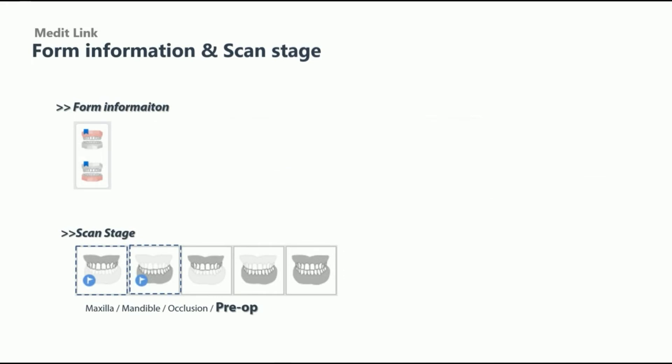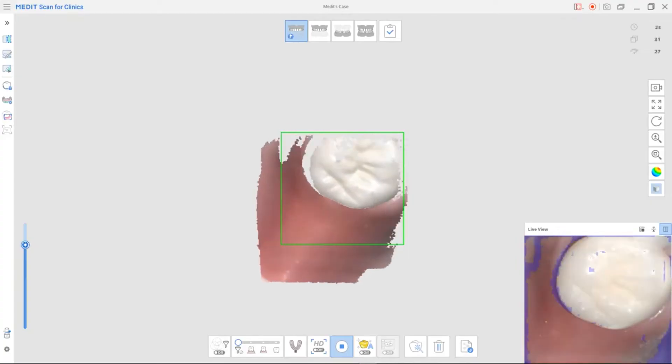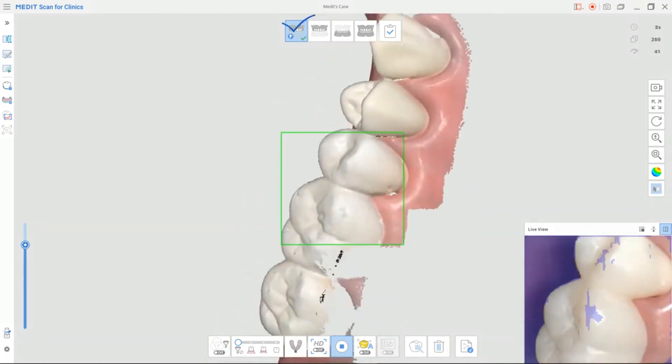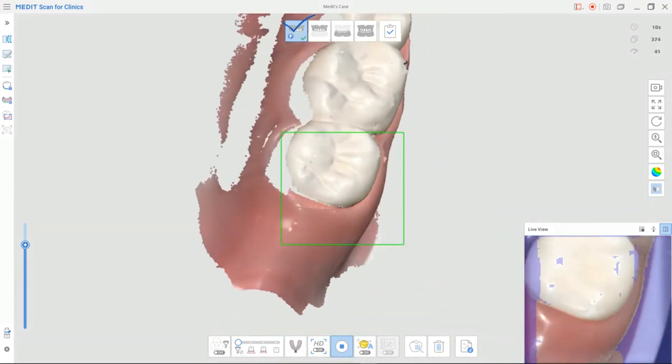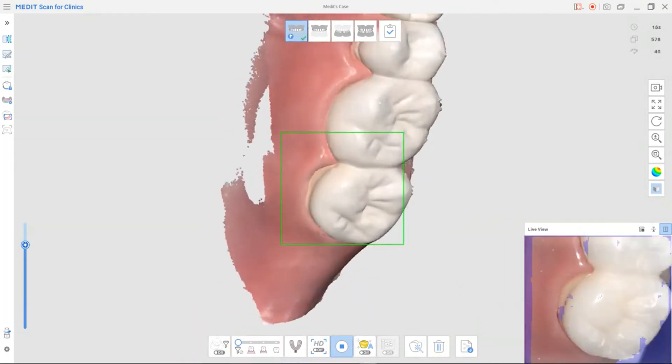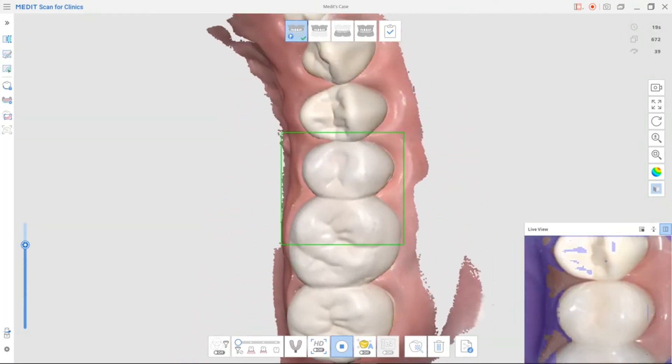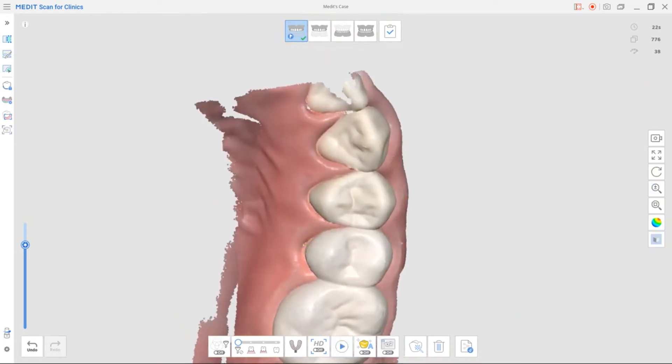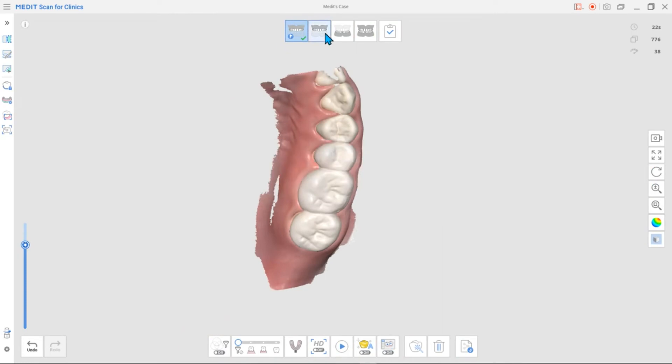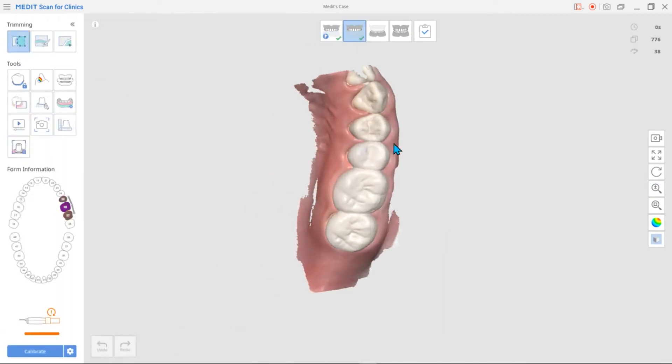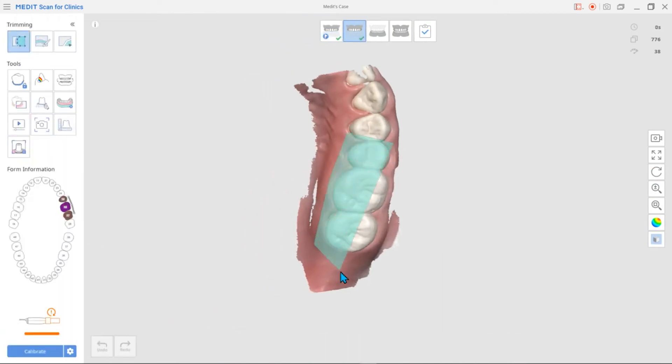You can also add a pre-op stage for both the lower and the upper. Pre-treatment conditions can be scanned in the pre-op option. For example, if you plan to restore a crown case, you can scan a temporary crown or the natural tooth before preparing the tooth.